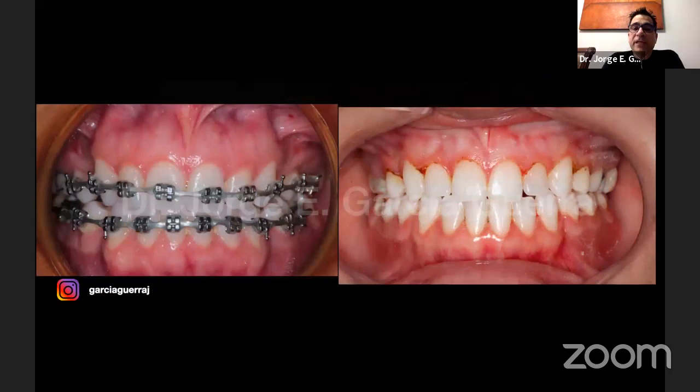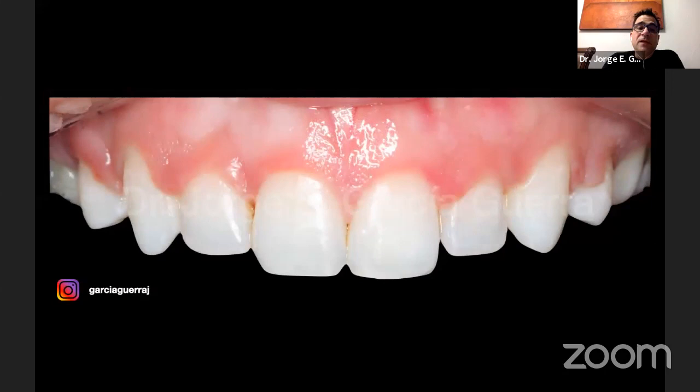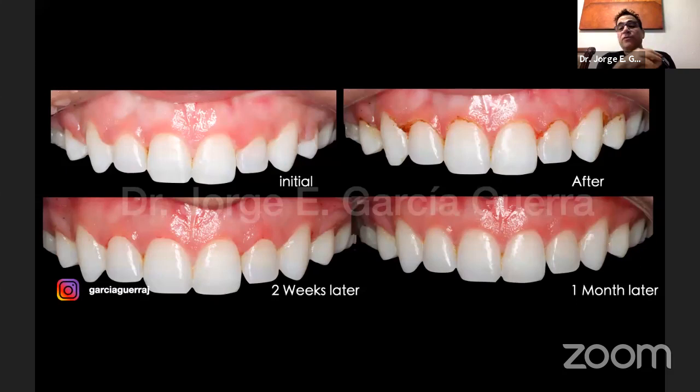Now this is from the beginning, you can see the final, and this is a month later. You can see how it's all corrected, no inflammation. The tissue looks very good a month later. This is the beginning, and this is how it looks now. So it makes a great difference to do this gingival recontouring, because our patients are more satisfied with the treatment. Here's the initial, after the recontouring, 2 weeks later and a month later. It's already recovered the tissue.